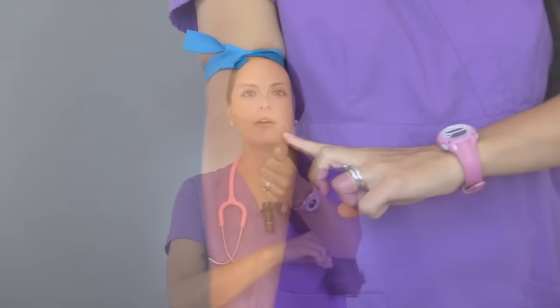Whenever you're first starting out, it's very foreign. I remember starting out and feeling on an arm thinking, 'What is that? Is that a vein?' And my preceptor would say, 'No, that's a tendon or a ligament.' What worked for me was taking a tourniquet, applying it to my own arm, and feeling my veins — or using my husband, a friend, or a family member who was healthy and had great veins, and just feeling throughout the arm to get comfortable with how that vein feels.